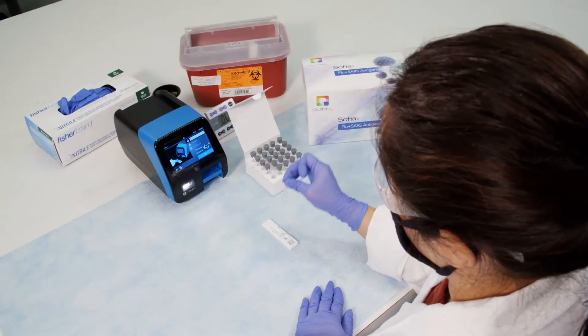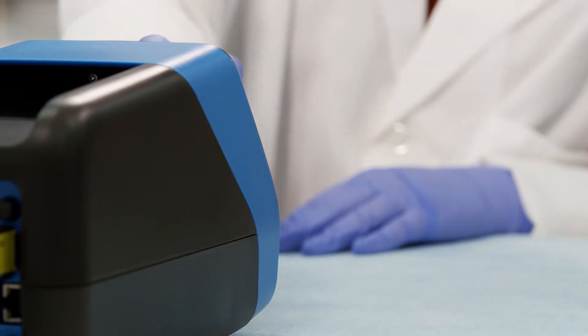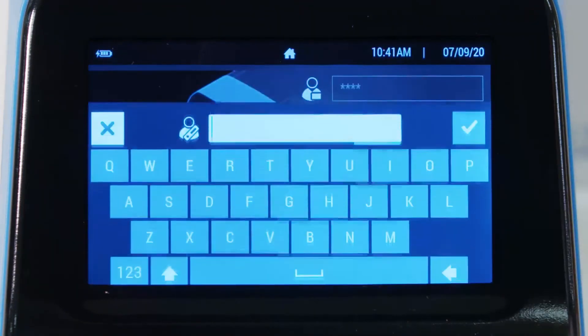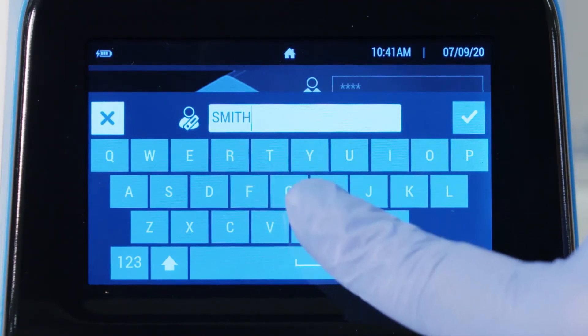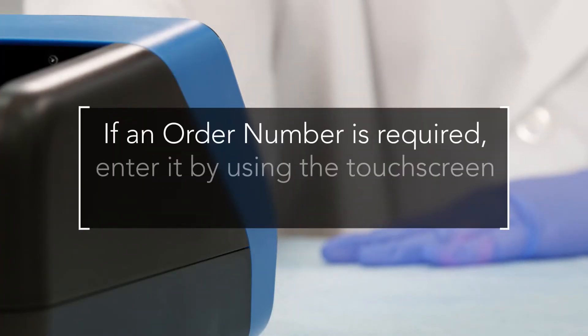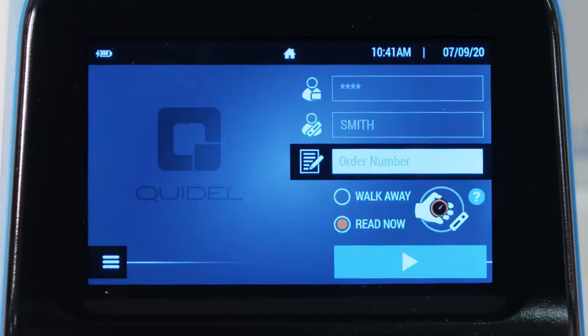To begin testing after emptying the contents of the patient sample into the cassette, ensure SOFIA2 has been powered on and the run test screen appears. Enter the user ID and patient ID by using the touch screen or integrated barcode scanner. If the user has manually entered the user ID or patient ID, press the check button. If an order number is required, enter it by using the touch screen or integrated barcode scanner. Ensure that SOFIA2 is set to the desired mode — read now, or in the case of this demonstration, walk-away mode — and press the start test button.